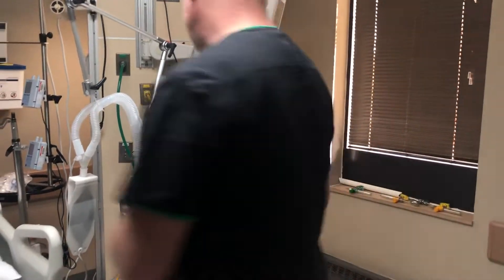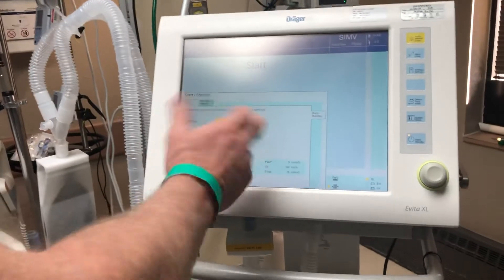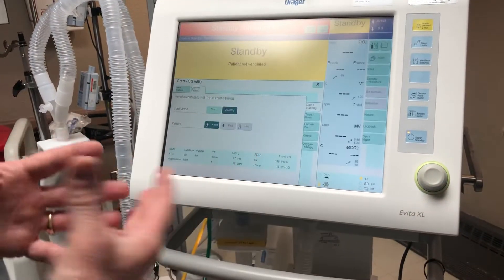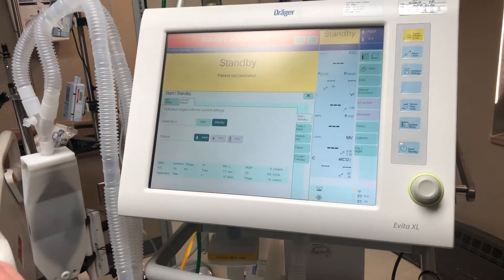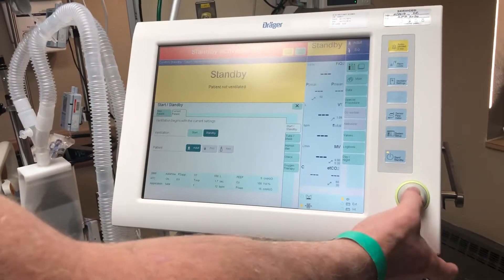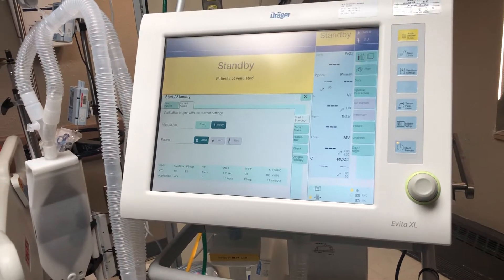Once that gets done, we're going to push it into standby. Hit standby, then hit this button here to put it in standby. It will alarm off at you at this point. All you've got to do is hit alarm silence on top, then hit the button again — that takes away the alarm and the red banner as well.